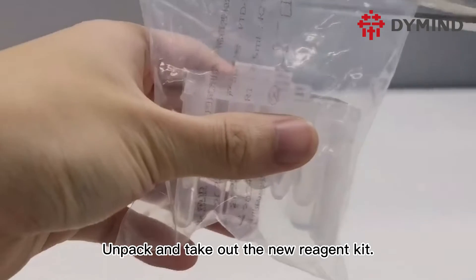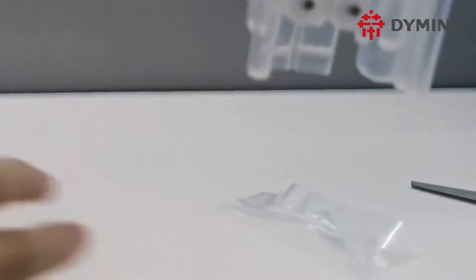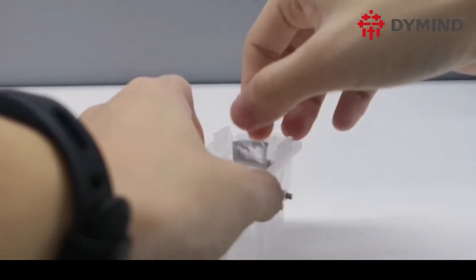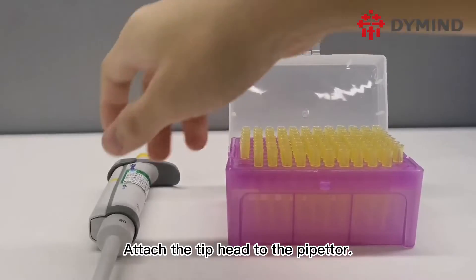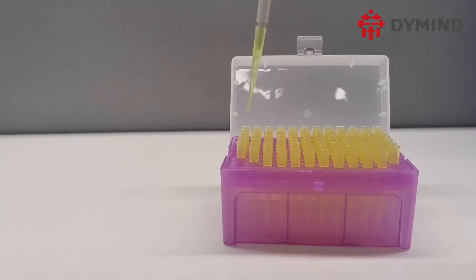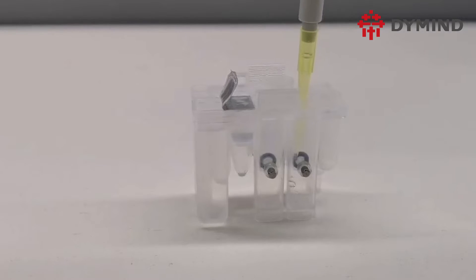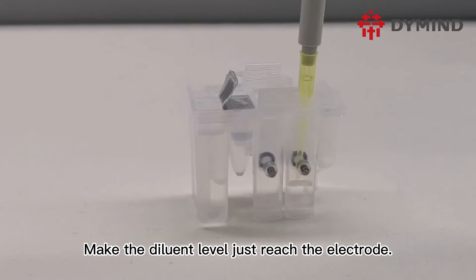Unpack and take out the new reagent kit. Remove the foil from the diluent. Attach the tip head to the pipettor. Use the pipettor to add the diluent to the WBC chamber, making the diluent level just reach the electrode.